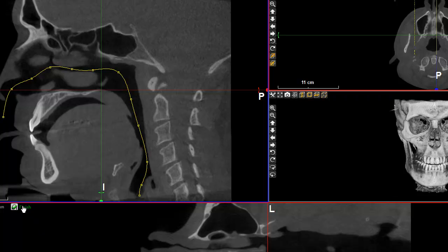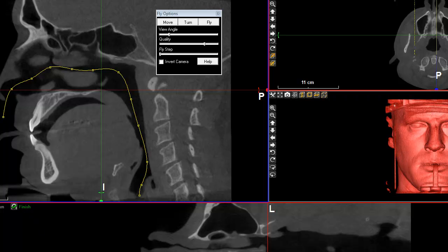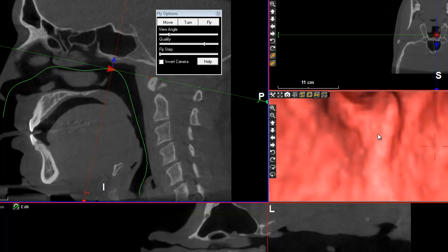And I'm done. You can see that there are some things that are changing here — this view is being calculated. And what we are going to be able to do is navigate through this path into the throat of the patient.